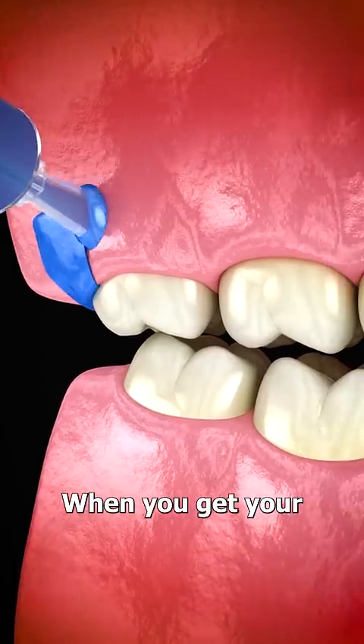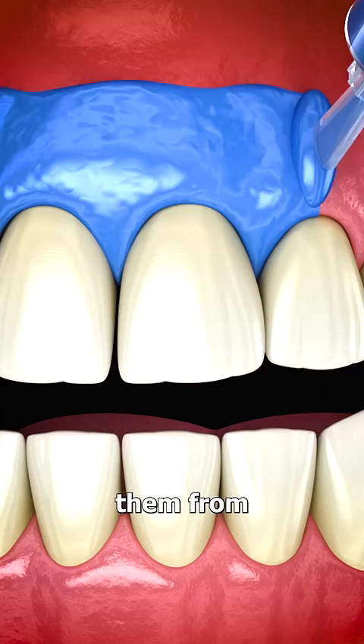When you get your teeth whitened, a dentist will cover your gums in a protective barrier to shield them from the chemicals. Then, a concentrated bleaching gel is added to each individual tooth.